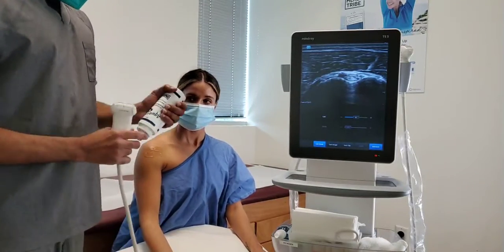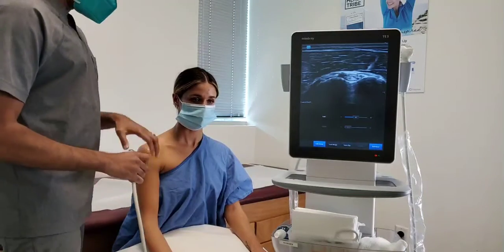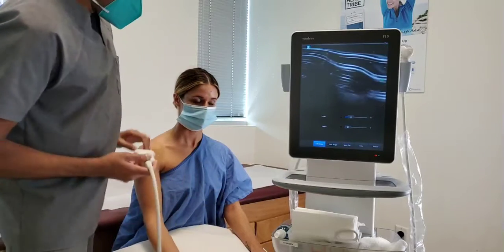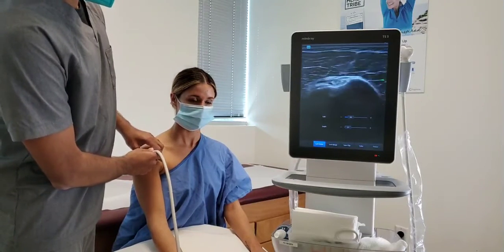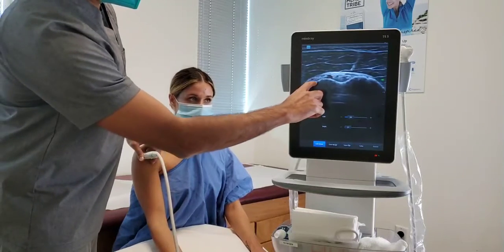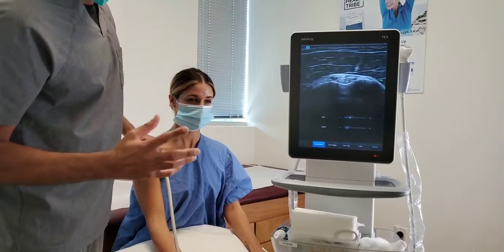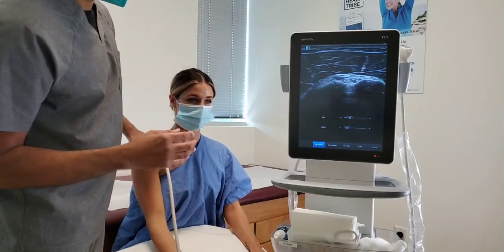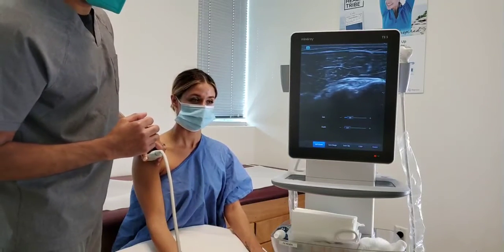So first, we're going to start with the front of the shoulder and what's called the biceps tendon. So here we're looking at the front of the shoulder, and you can see this structure here is actually the arm bone. Ultrasound, as a side note, is actually sound waves that bounce off of different structures.